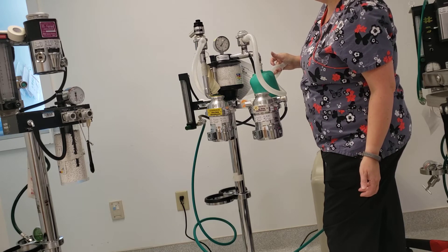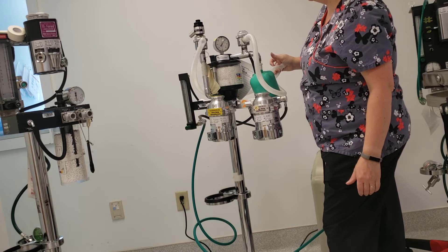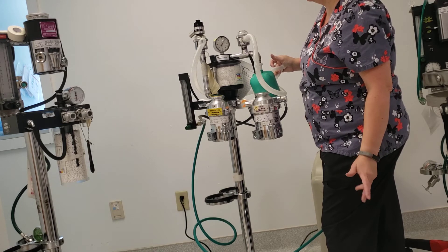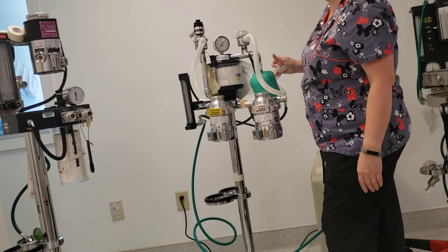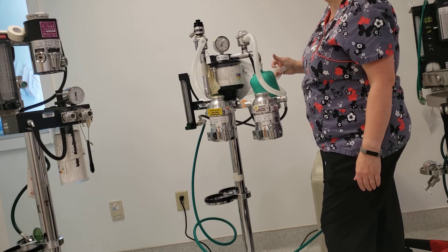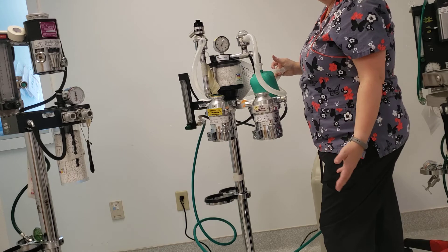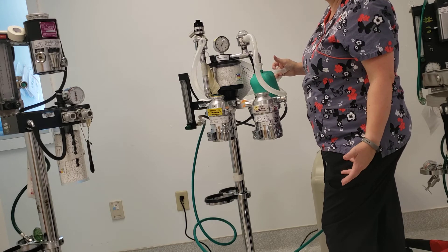According to the manufacturer, the reading can drop slightly. As I've been standing here talking over the last 30 seconds, it's dropped 2 ticks very slowly. This system is able to hold oxygen — your pet is able to breathe through it. It's within manufacturer standards and is considered a slight acceptable leak.